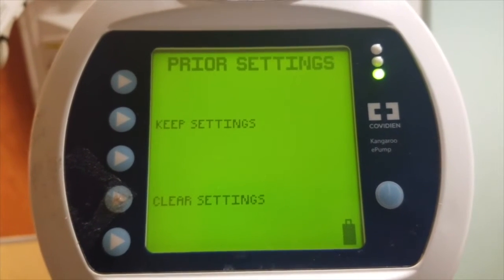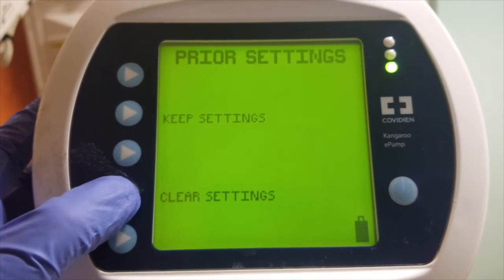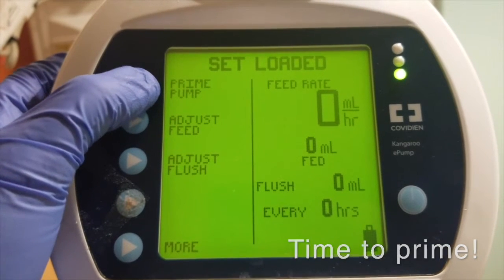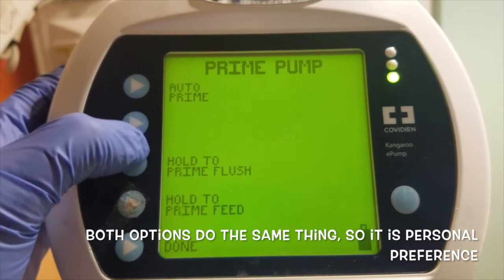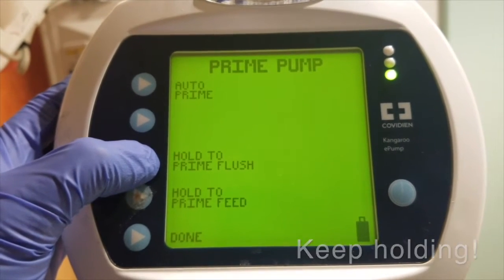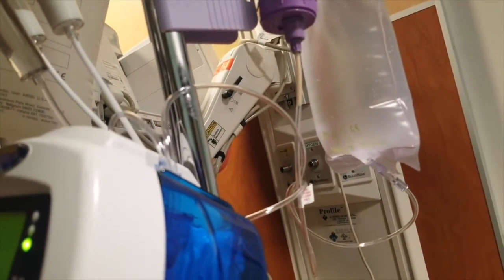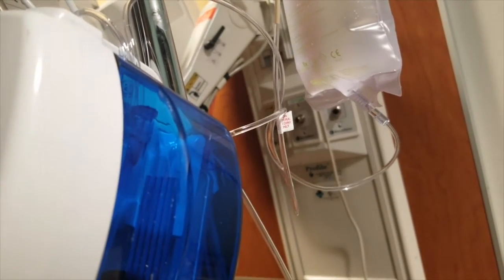There is an option to keep or clear settings. The keep settings will automatically program the last setting that was put in. I am going to press clear settings. Now it's time to prime the pump. You can press auto prime, but I like to manually prime it myself for better control. Press the button that says hold to prime flush. Keep holding and you can see water from the flush bag priming the tubing. I keep holding until the water reaches the door handle.